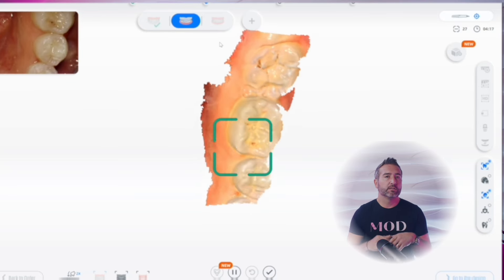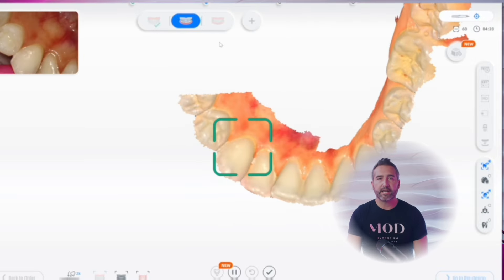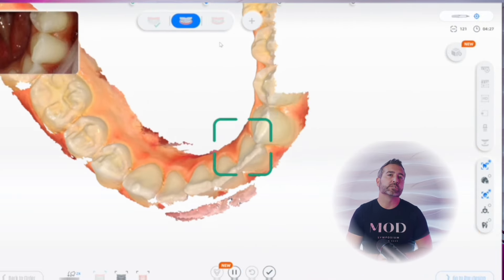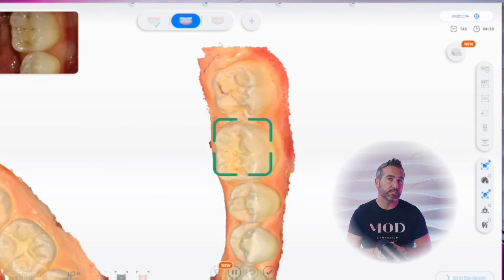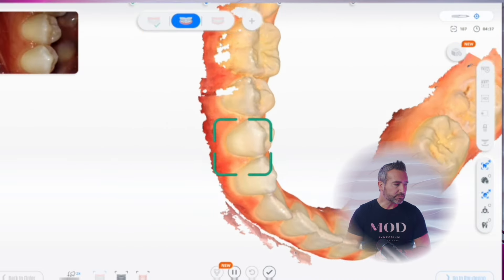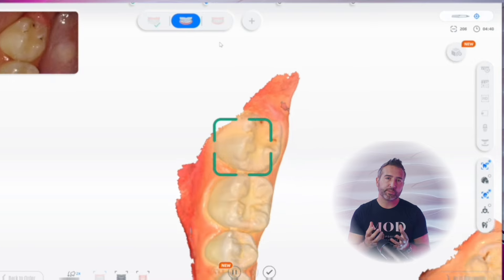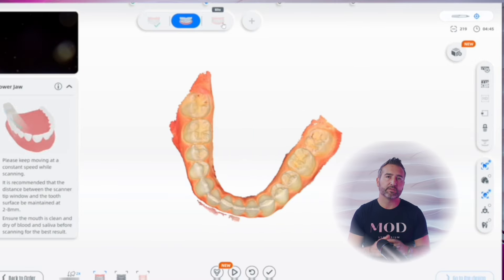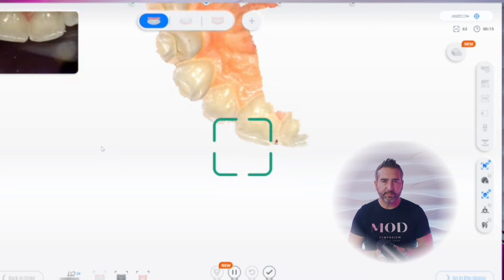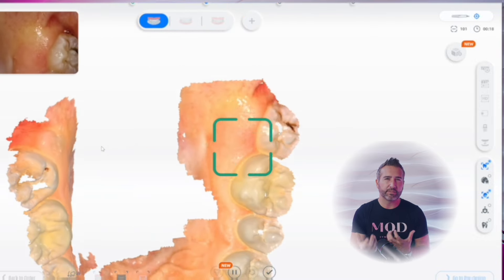We had a variety of cases with a bunch of different operators scanning from inexperienced to experienced. Starting with complete arch diagnostic scanning with AI turned on — it's really easy to use. It tracks super fast and auto-deletes any extraneous lips, cheek, tongue, or fingers that you might have accidentally scanned. The color is super bright so even in dark deep areas of the mouth it's extremely illuminated, and with the AI on, scan pattern is not quite as important because the camera won't really let you mess up.